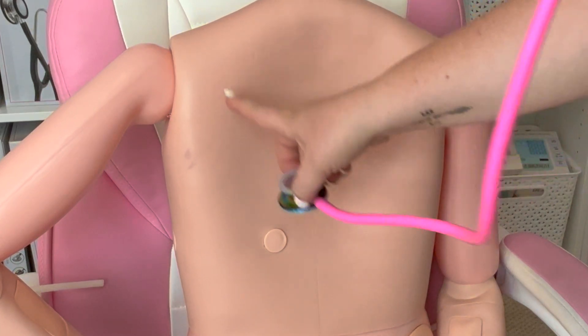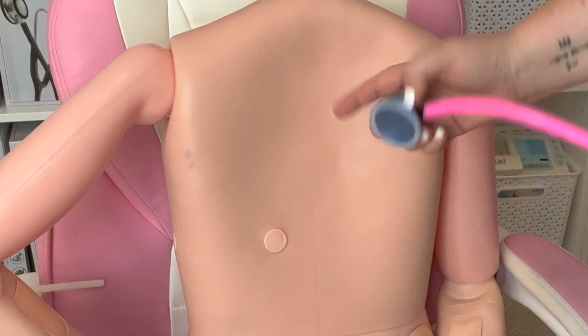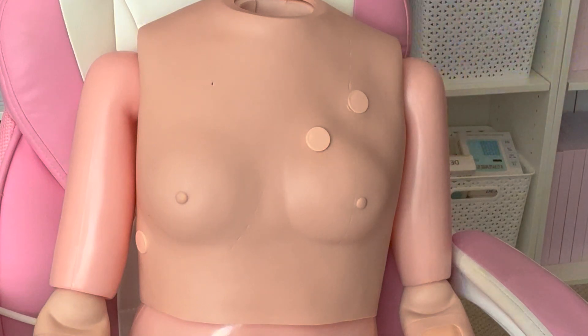As you can see, I was doing that S shape pattern with the back as well as the front. While we listen for the heart sounds, you're again going to keep it on the diaphragm, and you have your auscultation card to give you a guide of what you're looking for and listening for. So we're going to start with this side.